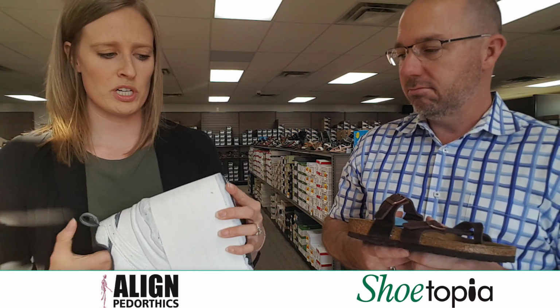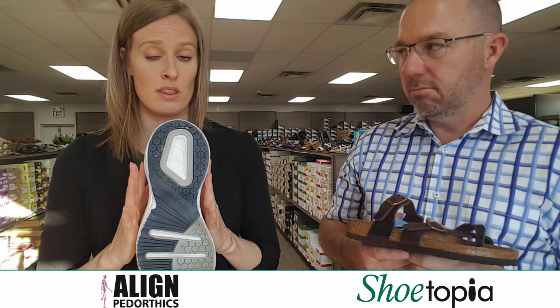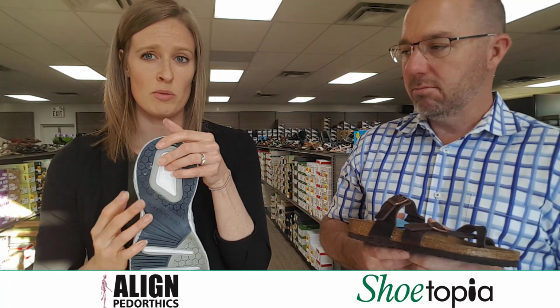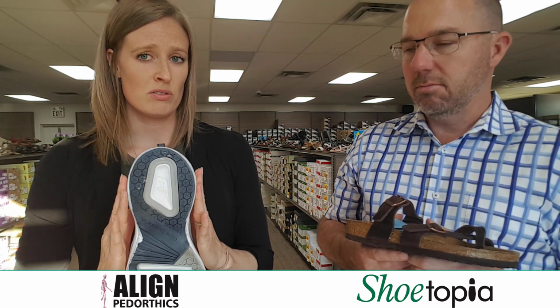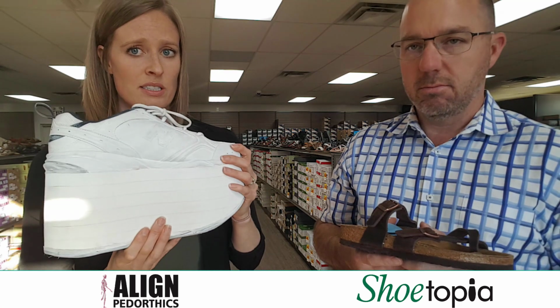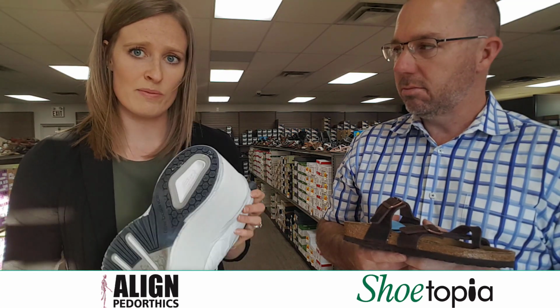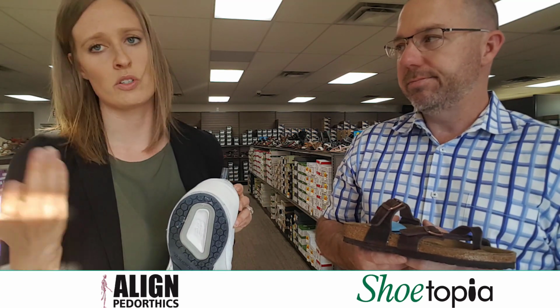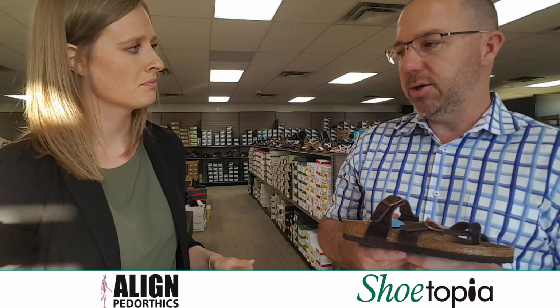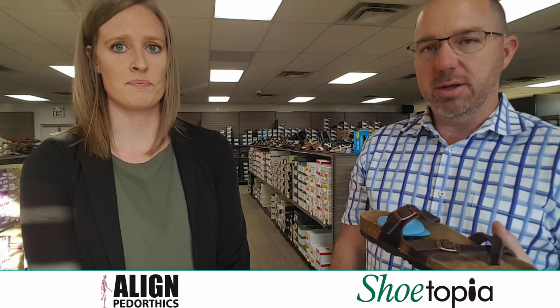A couple general things to keep in mind: the wider the base of the shoe, the better. This one is almost even a little bit narrow in through here, so go a little bit wider, say for a walking shoe. That gives you the most stability side to side, especially with a lift. And you also want to stay away from something that has some gel or some air pockets in it, as those are just hard to cut into. Right, and you're not going to get the structural integrity you're looking for as part of the base.